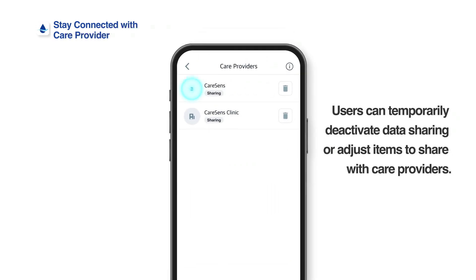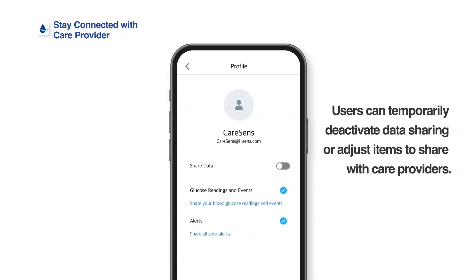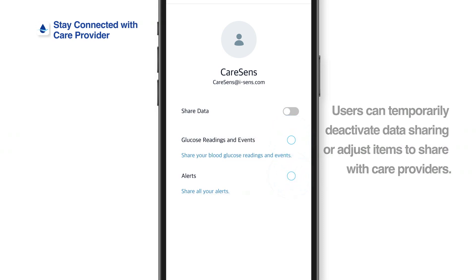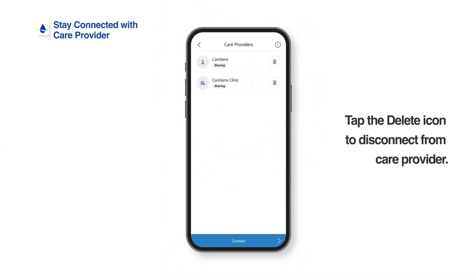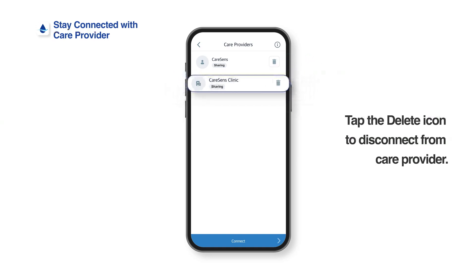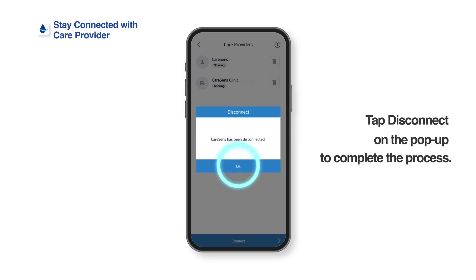You can temporarily stop sharing glucose data with your care provider or change the items shared. Tap on Share Data to activate or deactivate sharing. Tap the checkboxes to stop sharing data on glucose readings, events, or alerts. Tap the Delete icon if you want to disconnect from your care provider, then tap Disconnect on the pop-up to complete the process.